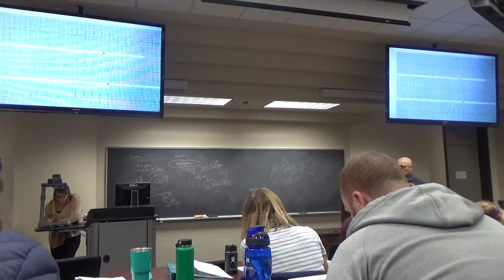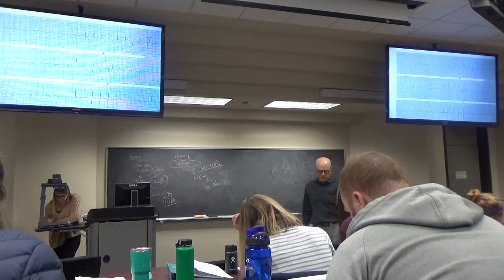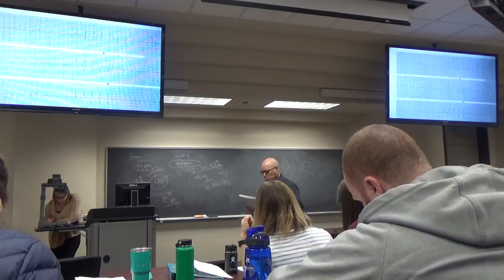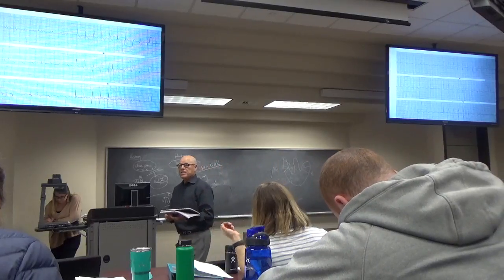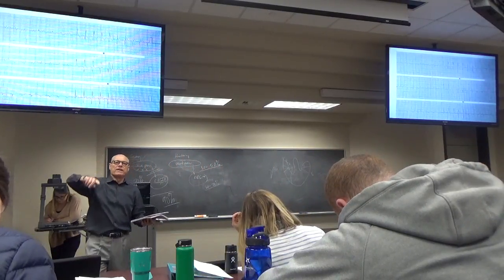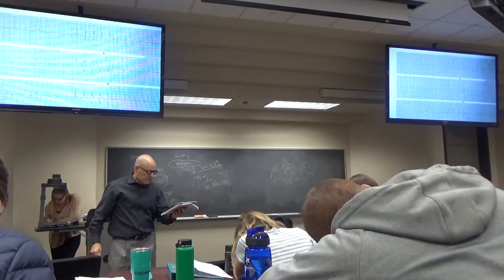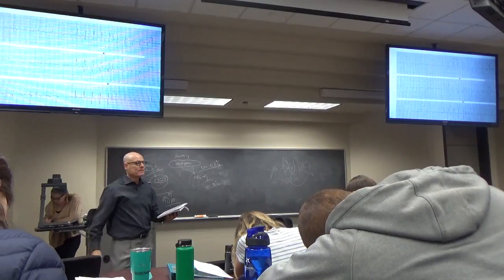And the reason I looked really, really closely is because II, III, aVF and V6 looked weird to me. V6 is supposed to have much more R wave than S wave. This one has a really deep S wave. It's not only deep, it's wide.